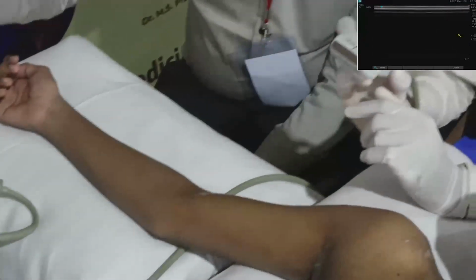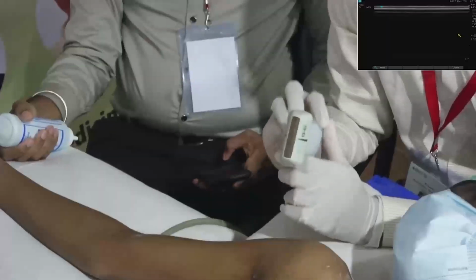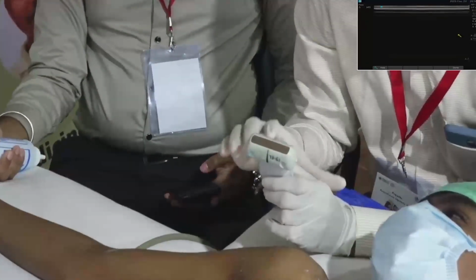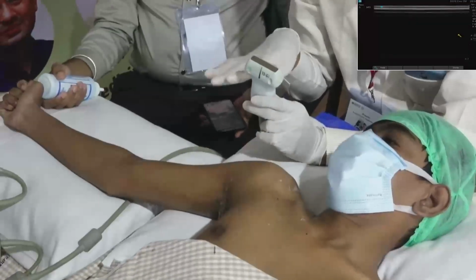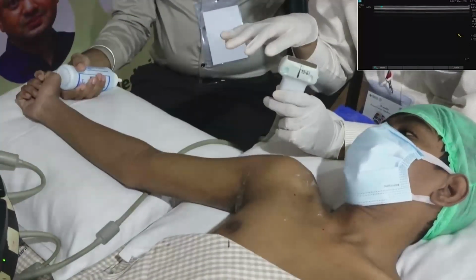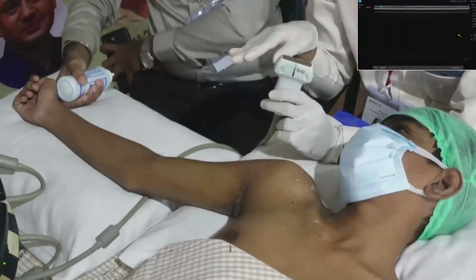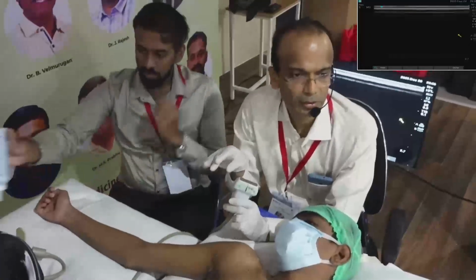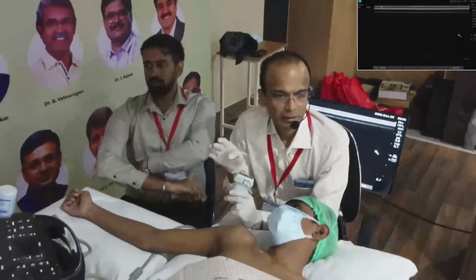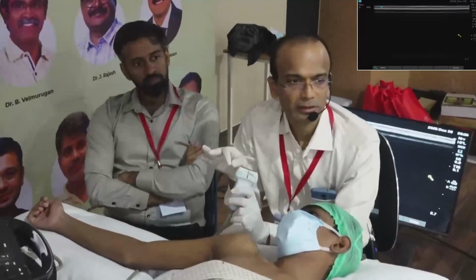So if you want to give a block for the shoulder and proximal humerus, the preferable block is the interscalene block. If you want to lessen the chance of phrenic nerve involvement, it is better to go for an upper trunk block.